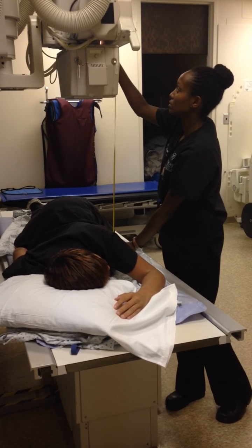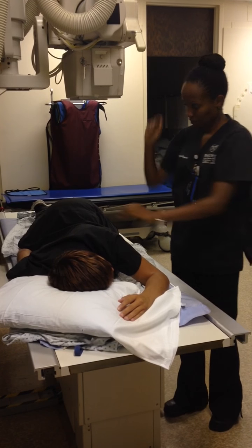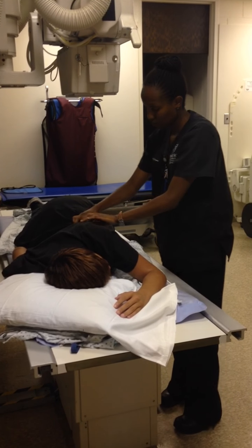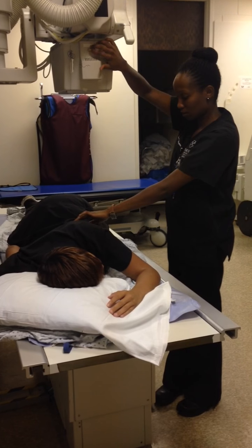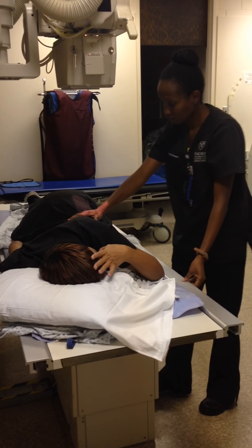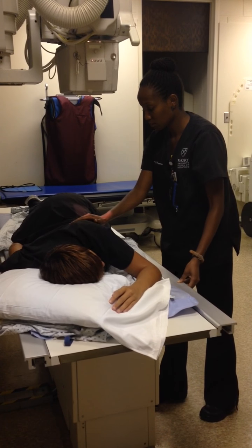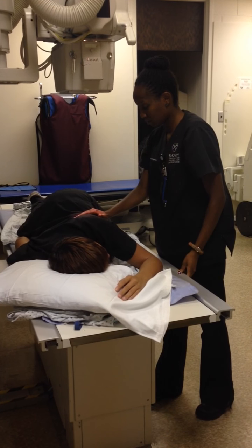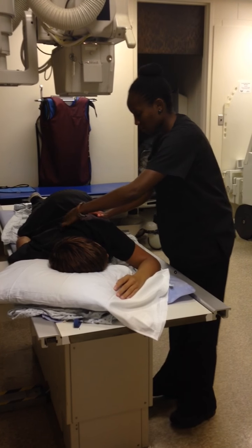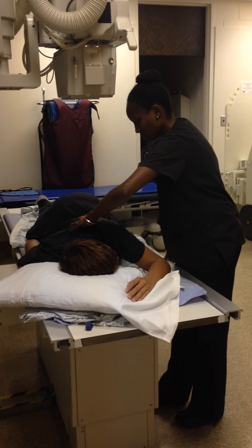Once the patient is in position, the technologist will need to physically localize T5 and T6. To localize T5 and T6, first localize T7, the external landmark of the inferior angle of the scapula. Once T7 is located, center the central ray 1 to 2 inches superior to localize T5 and T6. To center left to right, first localize MSP at the spine and then 2 inches laterally towards the elevated side. The central ray will be perpendicular to the image receptor.